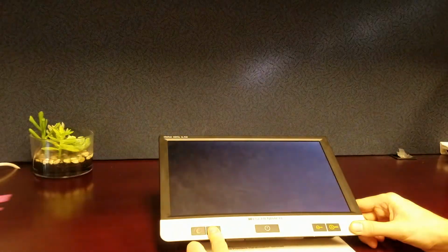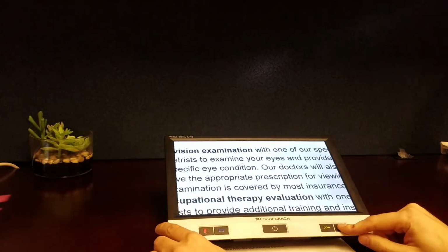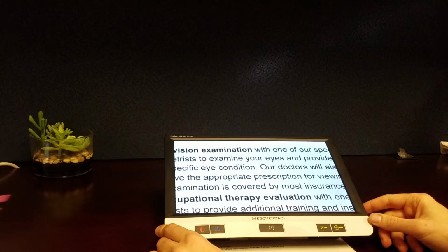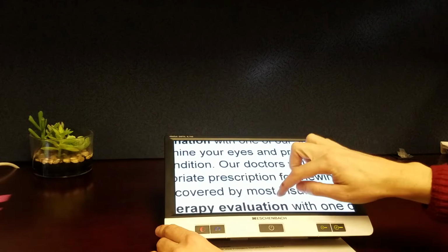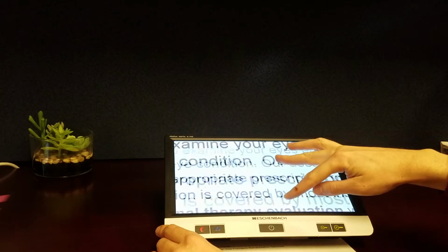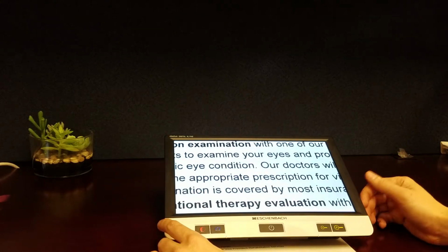Press that button, it will freeze the image on the screen. Now if I lift up the device, the image is still there. And we can still magnify that image and so on and so forth. Now one of the cool things about this device is it actually has a touch screen, and we're seeing this more and more with these devices now. So if I do magnify my picture, I can now use the touch screen to pan around that picture, which is really cool. So we can just move around the picture using the touch screen. We can even change the size of it using the touch screen, and that would be with our pinch and reverse pinch gestures that we might be familiar with from using our smartphone or tablet.